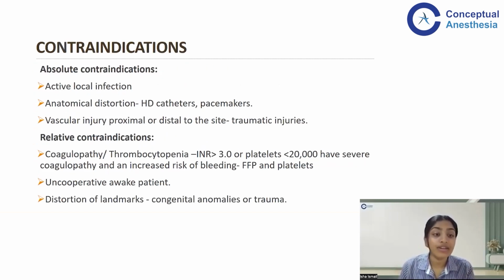Now, when we come to the contraindications, the absolute contraindications would be a local infection because this will seed the infection into the bloodstream itself. Anatomical distortions because of the presence of a catheter already or a pacemaker already, and vascular injury because, again, in a trauma patient, if there is injury to the proximal or the distal area, there's a break in the vasculature itself, so you cannot administer any drugs.